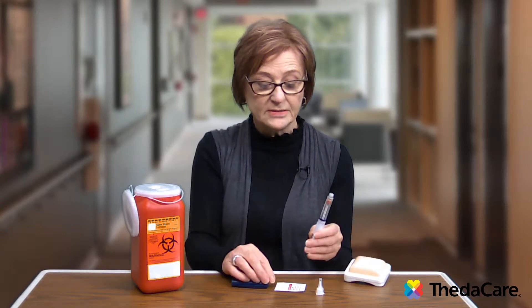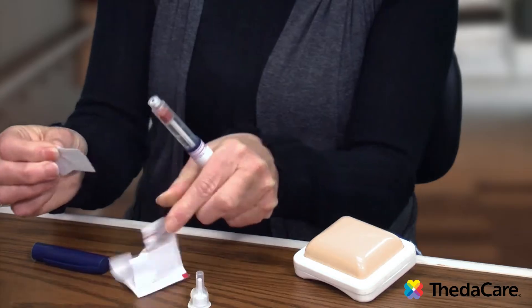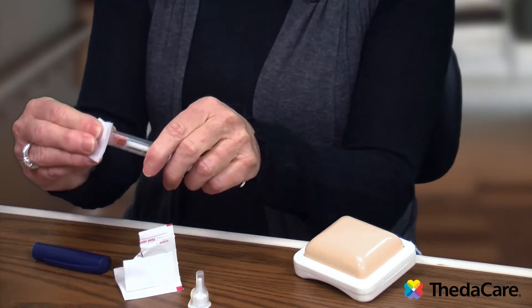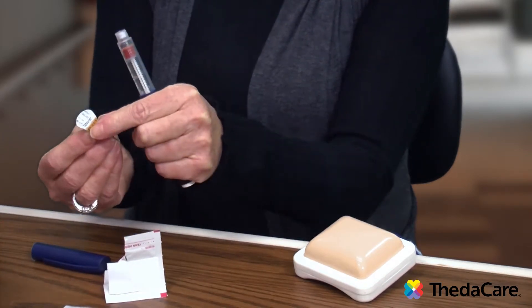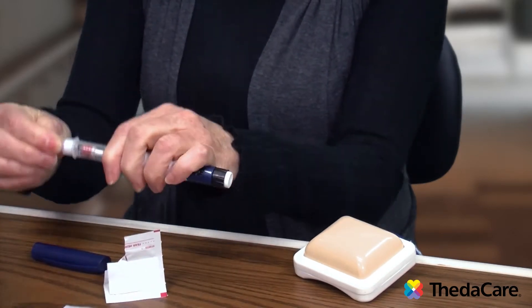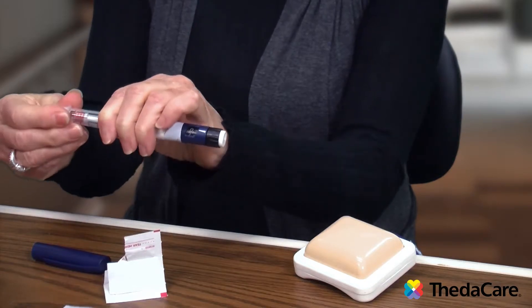Your next step is to take your alcohol swab and wipe off the little rubber stopper on the end of your pen. Once you've wiped that off, take your new needle, pull off the tab, push it straight on first, and then tighten it pretty snugly.